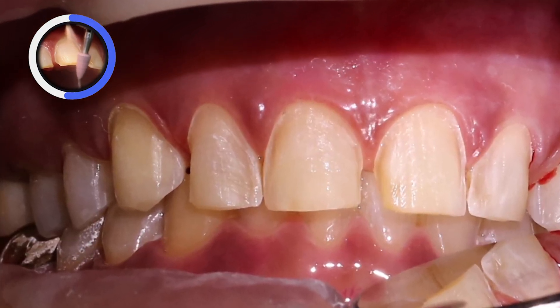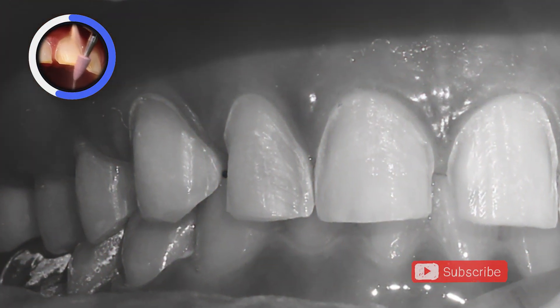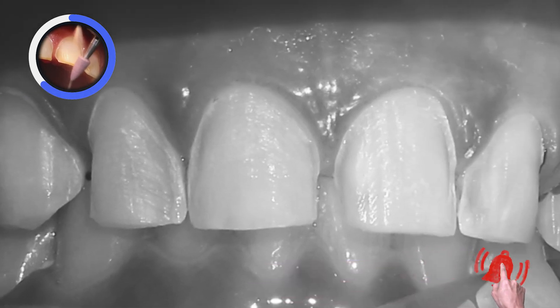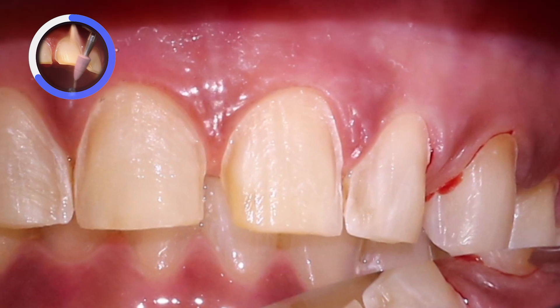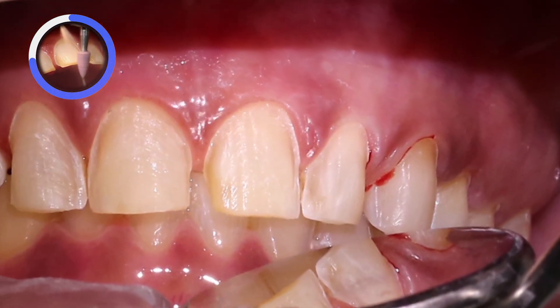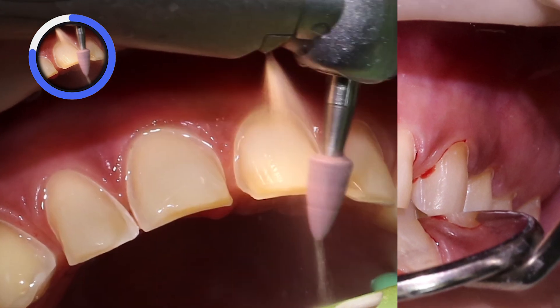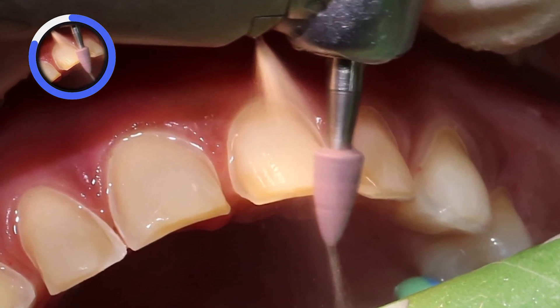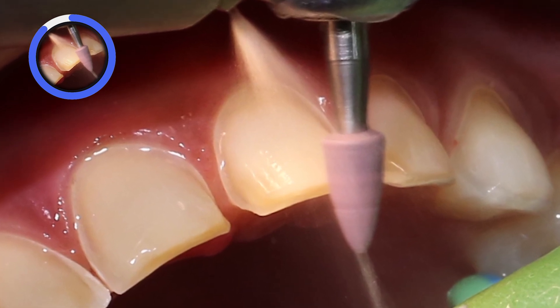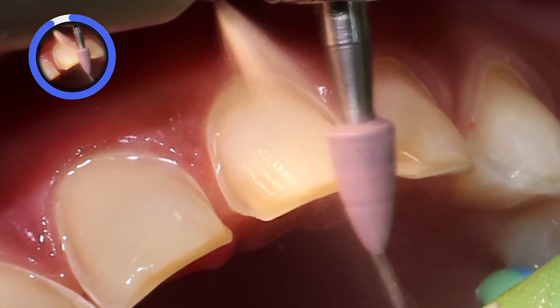When we prepare teeth, the axial occlusal or axial facial line angles typically result in a sharp angle since the burrs we use create flat planes. It's good practice to round these over to minimize the amount of internal stress placed on the final restorations. To ensure the labial incisal transitional line angle is smooth and rounded, I use a coarse venous super polisher along these aspects at 5000 rpm.